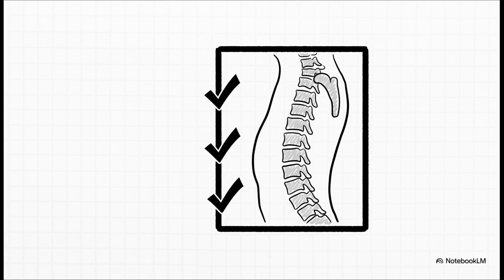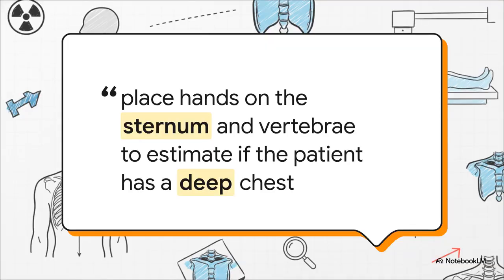And finally, ensure the lower portion isn't obscured by breast tissue, which might require some careful, respectful physical adjustments before you expose. I really want to emphasize this thought. Taking an X-ray of a hand is pretty straightforward, but capturing the sternum? That takes genuine technical skill. Nailing these subtle angles, knowing exactly when to drop to 30 inches or pull back to 72, reading the depth of a patient's chest, that's the stuff that takes you from being a decent technologist to an absolutely exceptional one.